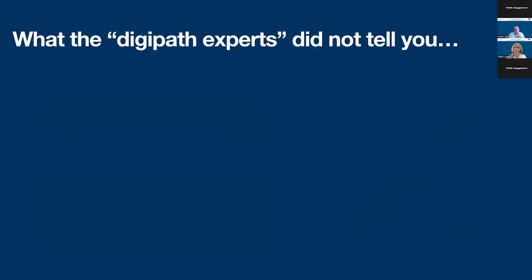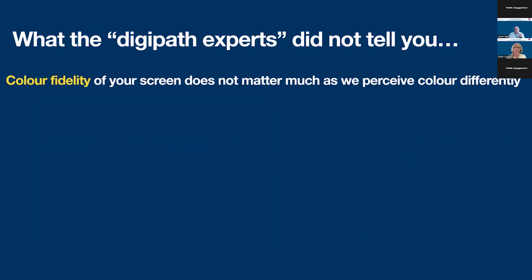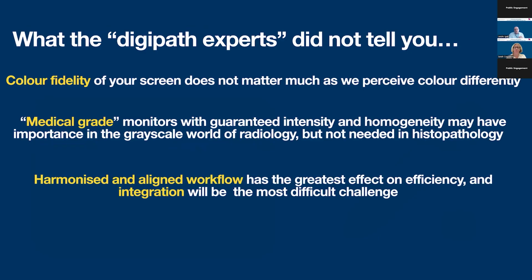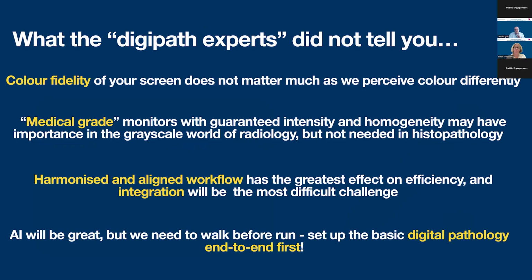A couple of things, and I will finish shortly. What the DigiPath experts are not telling you. Color fidelity doesn't matter as much because we all perceive colors differently, and our eyes have the ability to adapt. Medical grade monitor is a myth. We don't need it. Radiologists do because they have grayscale. Harmonized and aligned workflow probably has more effect on your digital workflow, together with the integration, than any technology. And most importantly, set up the basic digital pathology before you go AI; get end-to-end first.